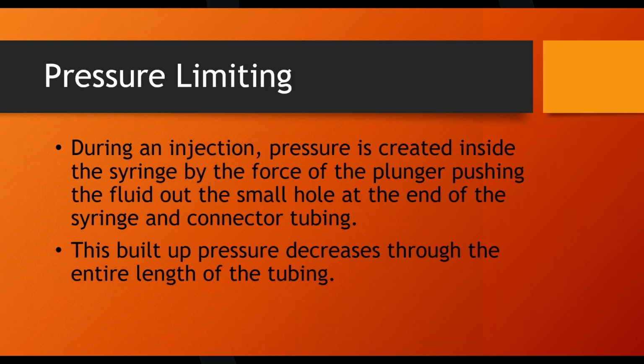This first line right here, that's referred to as a phase, and that's the first line of the injection. You'll notice that it's green. Green is the color code for contrast, so we're gonna shoot green. This first column is your flow rate. The second column is the volume. And the third column is the time of that.